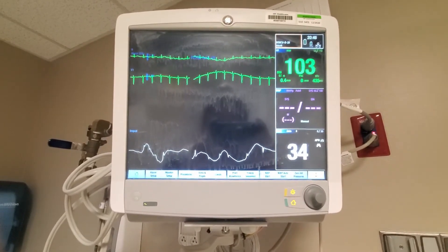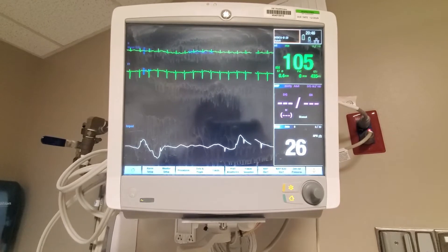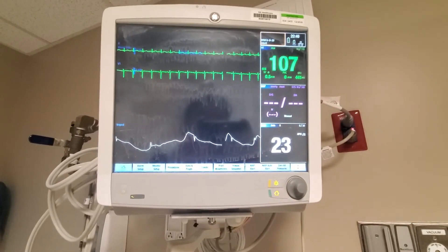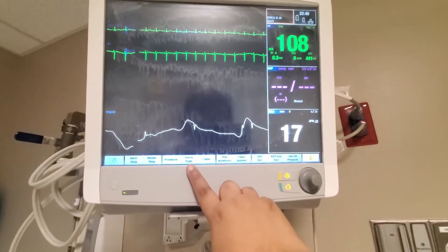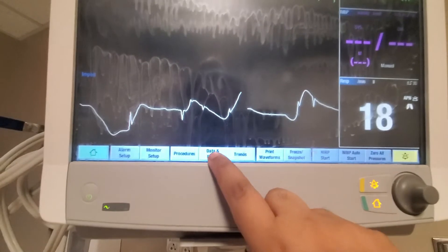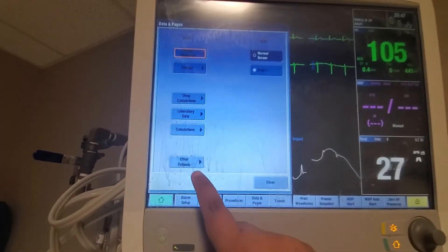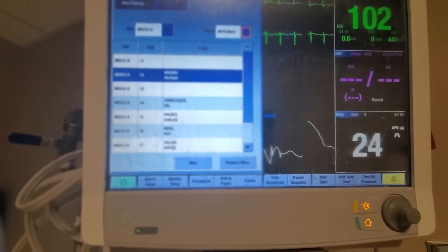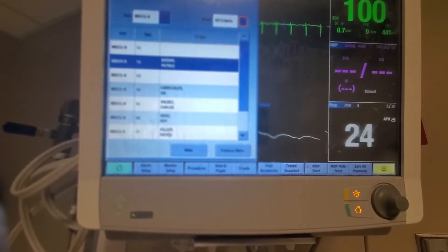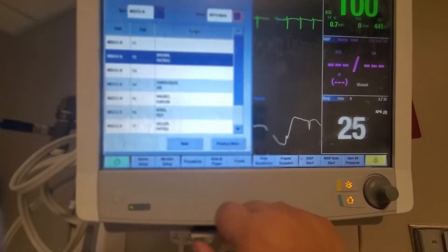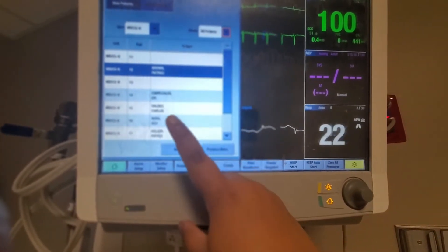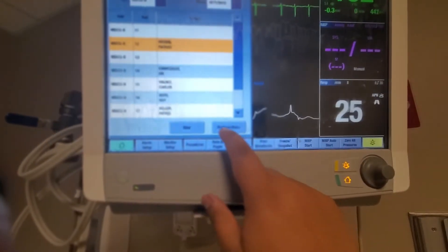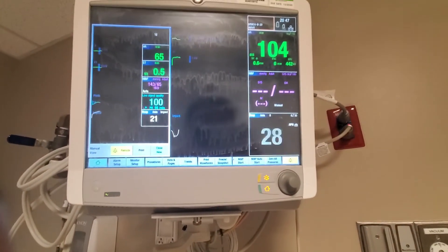Now let me show you how to view another patient on this monitor. If you're in a patient's room for a while and your other patient is on drips or you want to watch their vitals, go to data and pages at the bottom, click that, and on your screen at the bottom it's going to show other patients. Click there — I've blurred out patient names for HIPAA purposes — and choose the patient you want to see. Be aware that patients could potentially see other names and room numbers, so try to cover that information.